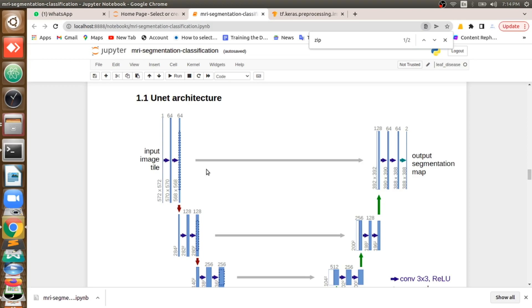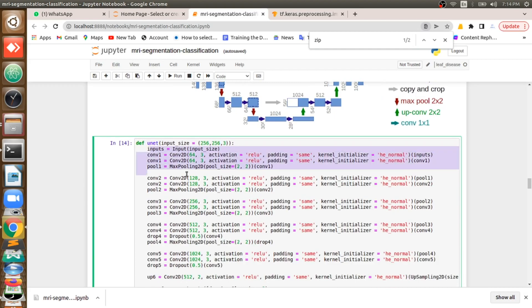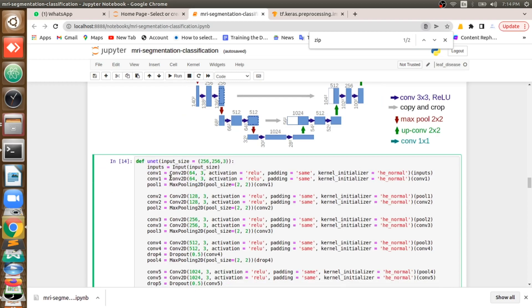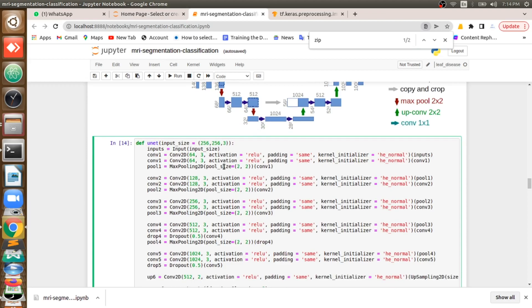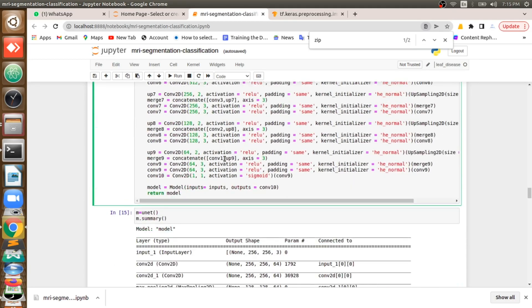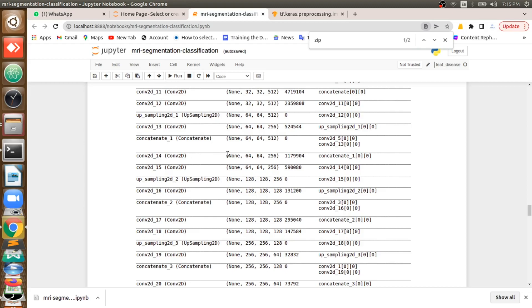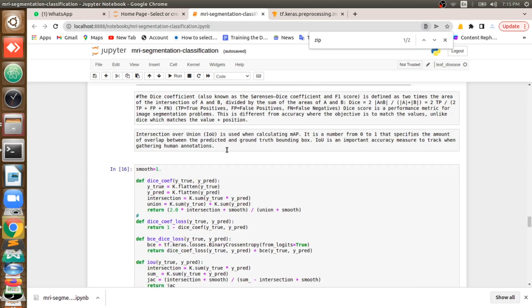Now I want to show the U-Net architecture we are using. As you can see below, we defined it — the same structure with the stack of layers used in U-Net architecture. The image size is 256x256 with three channels. We pass it through two Conv2D layers and one MaxPool2D, repeating this four times. After that we merge them, then do convolution and further steps as shown in the image. U-Net is a predefined deep learning architecture, and that is our model.